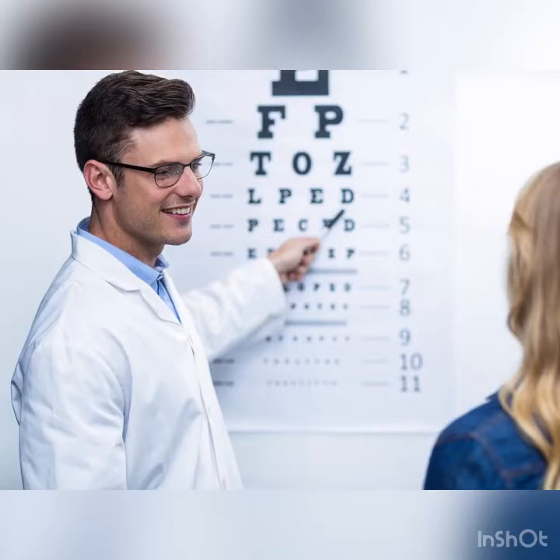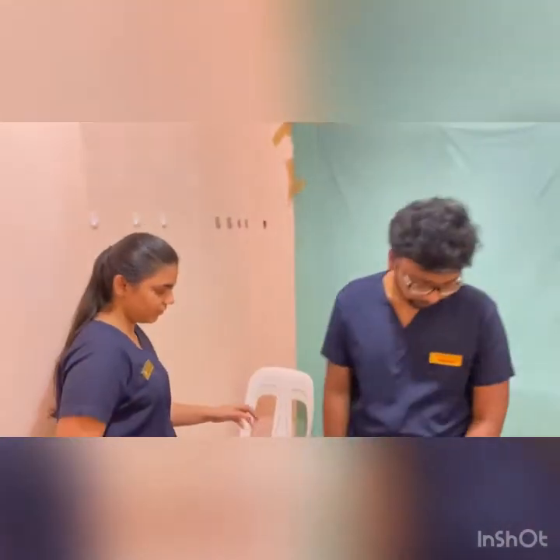The first important area of examination is visual acuity. For this, we use the Snellen chart. So now I'll be checking your visual acuity. The glasses you are wearing, are they just for reading or are they prescribed? This is prescribed. Okay, so can you please stand here? Make sure that the distance between the Snellen chart and the patient is 20 feet.